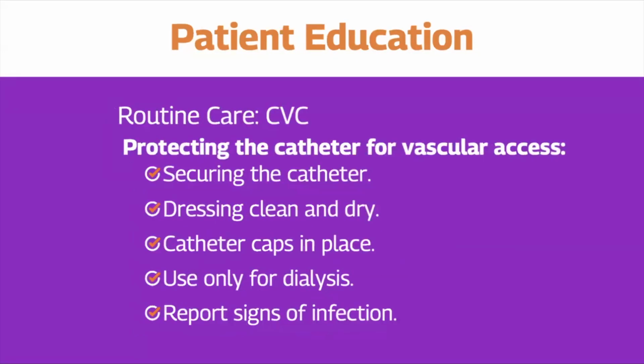What about the patient with a CVC? We want to protect that catheter the best we can by securing it in place, making sure the dressing is dry and clean, and the catheter caps are in place. Use it only for dialysis. It's not to be used for any other purpose, and report signs of infection.